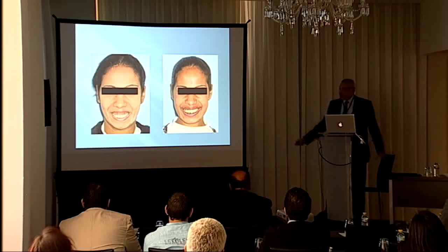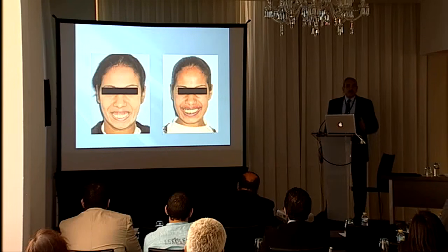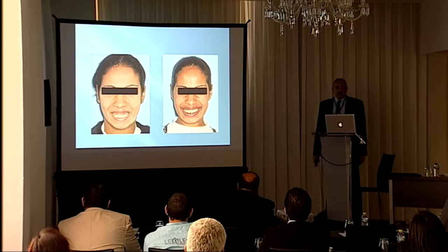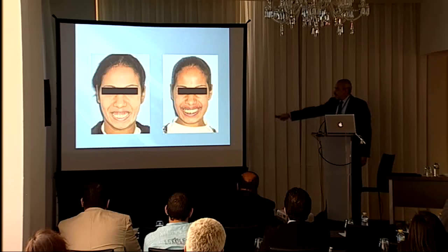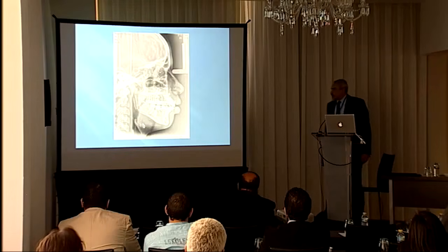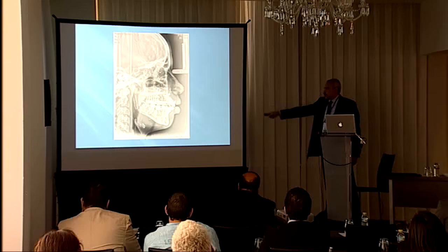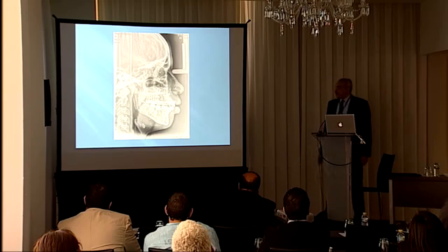What I'm trying to show here is that the patient is quite early postoperative and still has the arch wires in place. She had that much of a gummy smile, and now when she smiles, she's on the gum margin. That's her profile, and the X-ray shows that we actually did work in the maxilla and in the mandible as well.